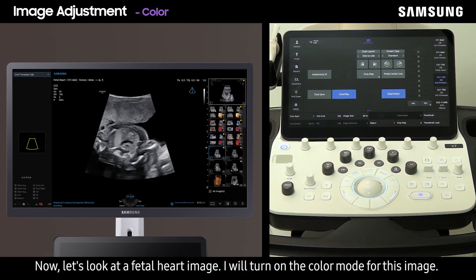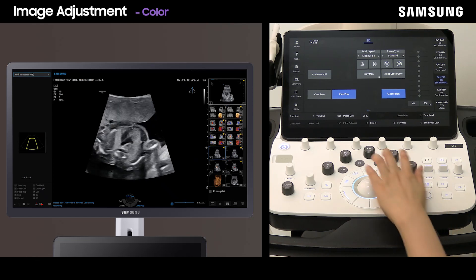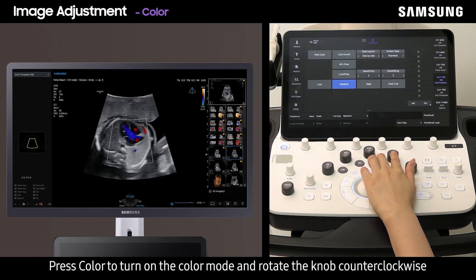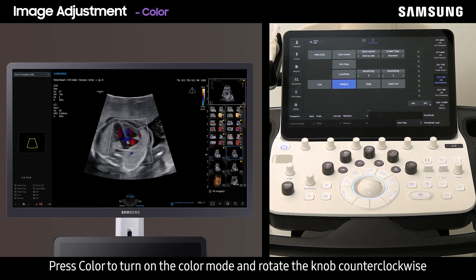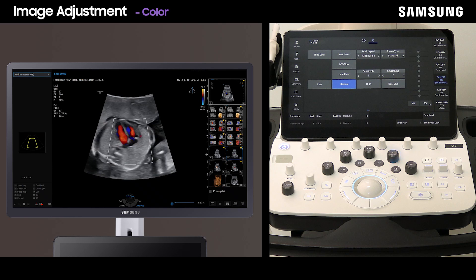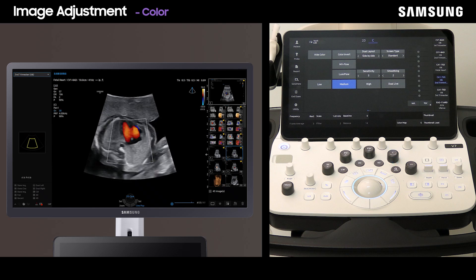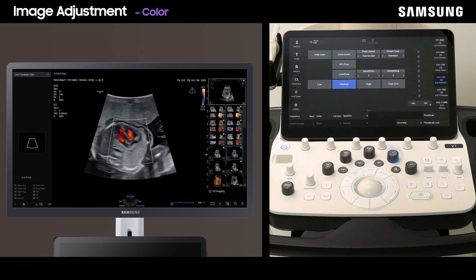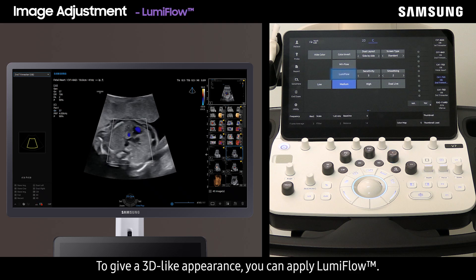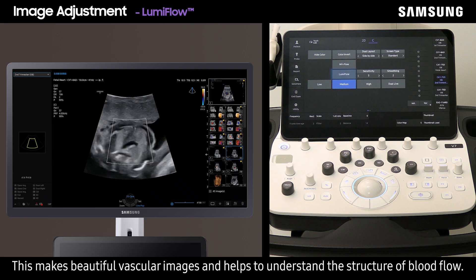Now let's look at a fetal heart image for a color demonstration. Press color to turn on the color mode and rotate the knob counterclockwise to decrease the color gain. To give a 3D-like appearance, you can apply LumiFlow, which makes beautiful vascular images and helps to understand the structure of blood flow.